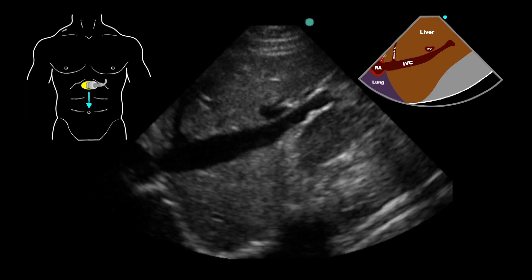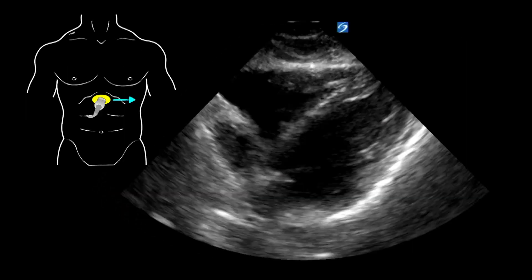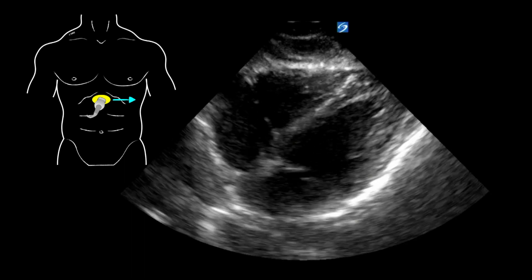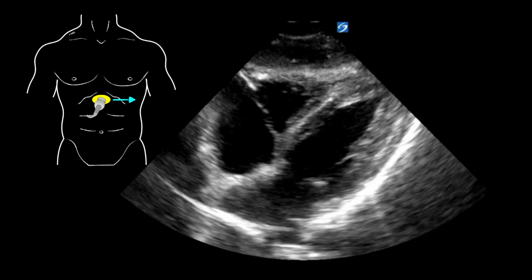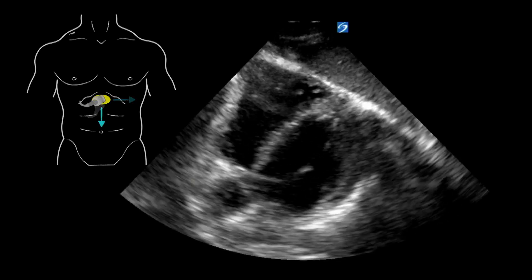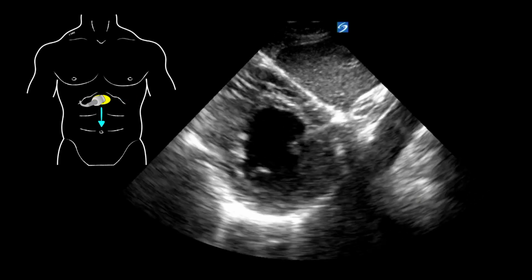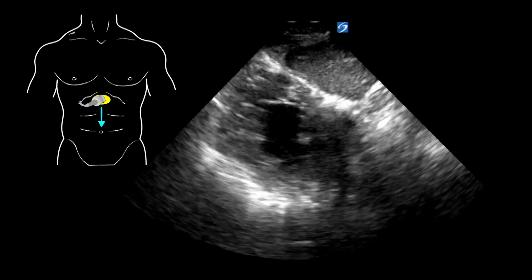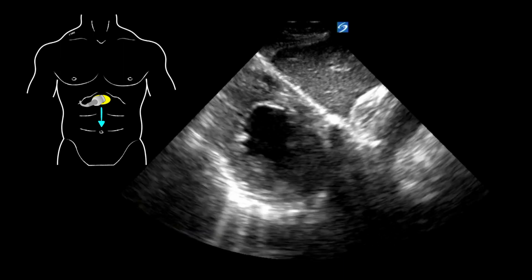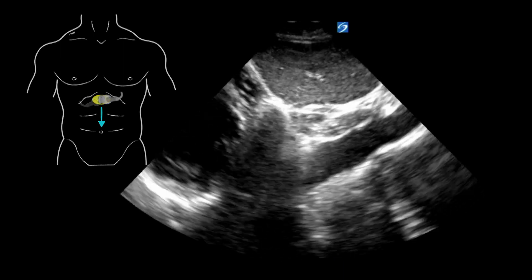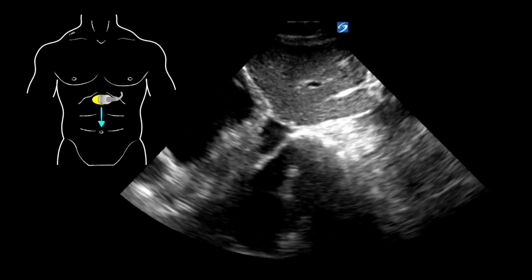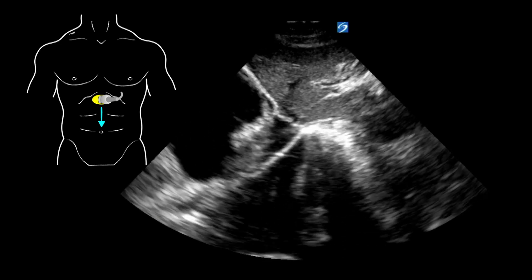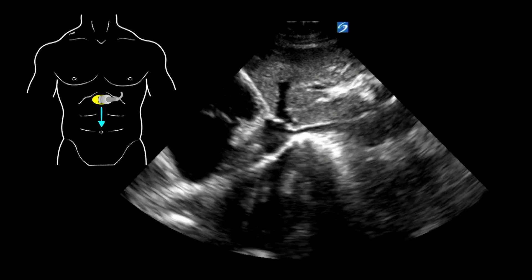Now I'm going to show you a study going through the different views. Here we see our four-chamber view of the heart, and we're going to progress to obtain the subxiphoid short axis view. We're going to start to rotate the probe — we see the mitral valve come in, then we see the papillary muscles right in the middle and can appreciate the contractility. From there, we're going to swing down, the diaphragm will move towards the left side of the screen, and then we'll see the IVC.